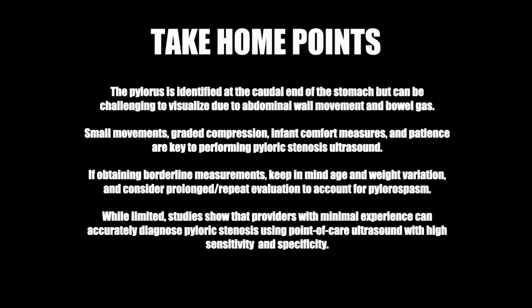While limited, studies show that providers with minimal experience can accurately diagnose pyloric stenosis using point-of-care ultrasound with high sensitivity and specificity.